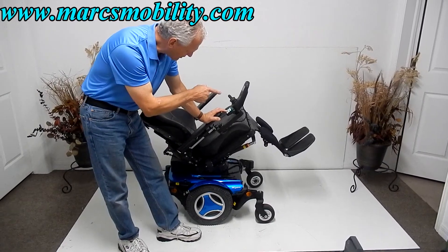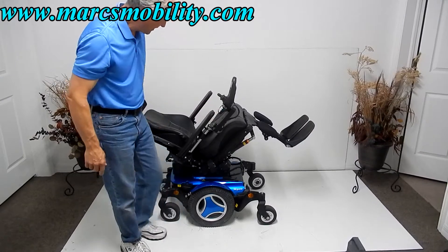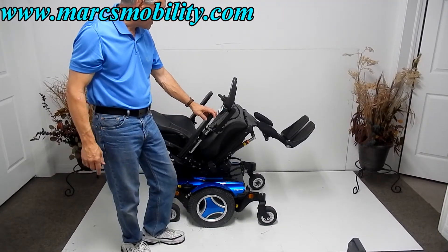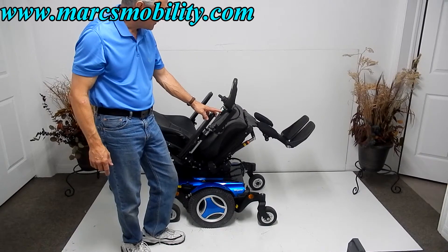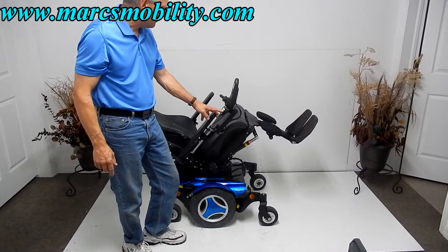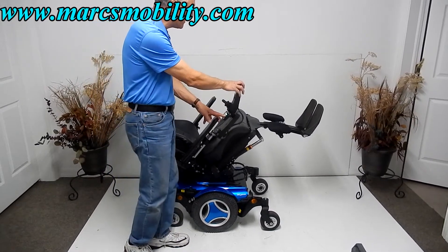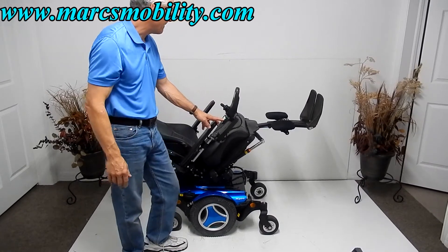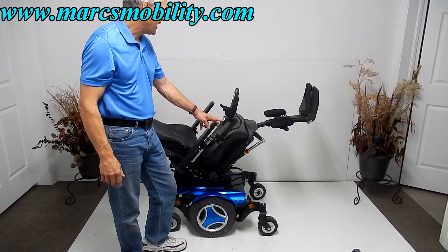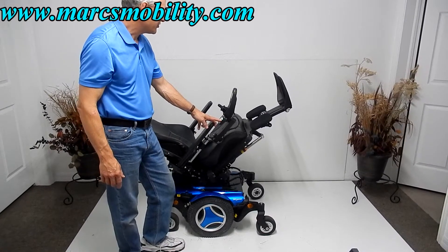The legs are adjustable on this chair. So if you wanted to be tilted, this would be your full tilt. The next thing I'm going to show is the electric legs. You can be tilted all the way back, and you can do both functions at the same time if you go through the joystick. If you do a function through the box, you can only do one function at a time. But this would be your electric legs — they go pretty much straight up.